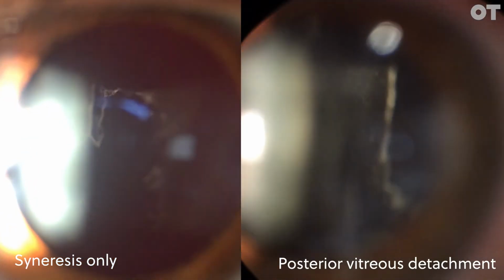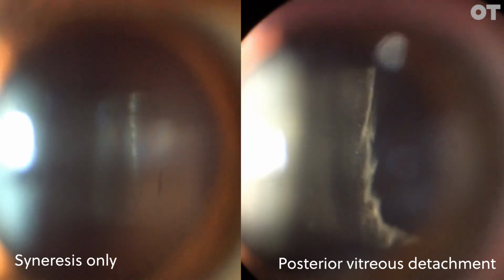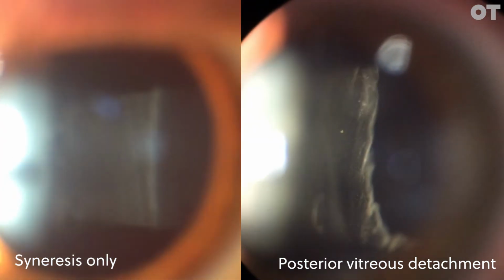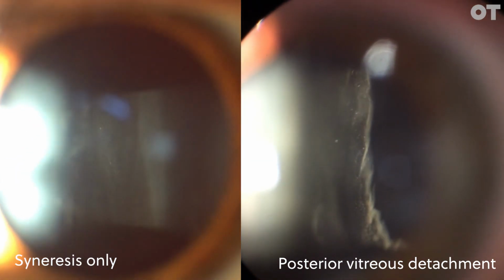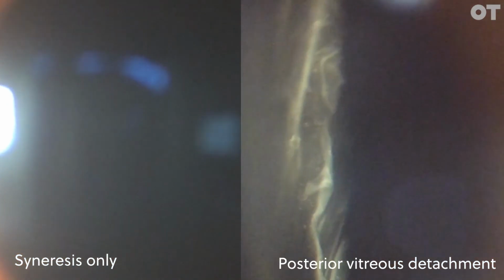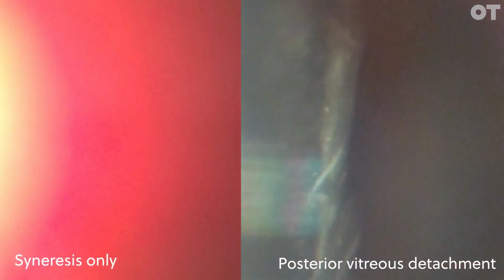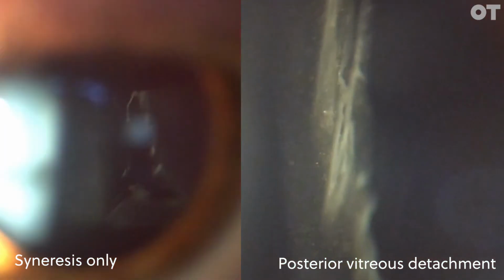Comparing the two side by side, just to make it even more obvious, you can see on the left we have a video of the patient with syneresis only, and on the right a video of the patient with posterior vitreous detachment. You can see they clearly look different. So you can see on this diagram on the right, you can see this wrinkled appearance of the posterior hyaloid membrane. It's clearly optically empty posterior to that.